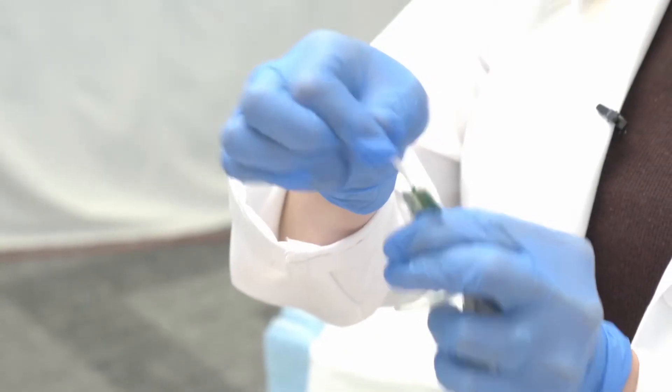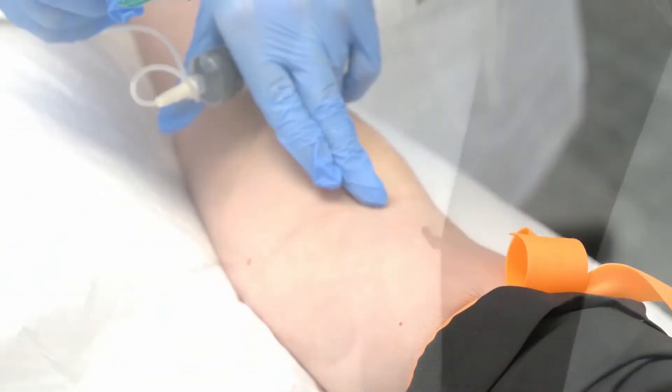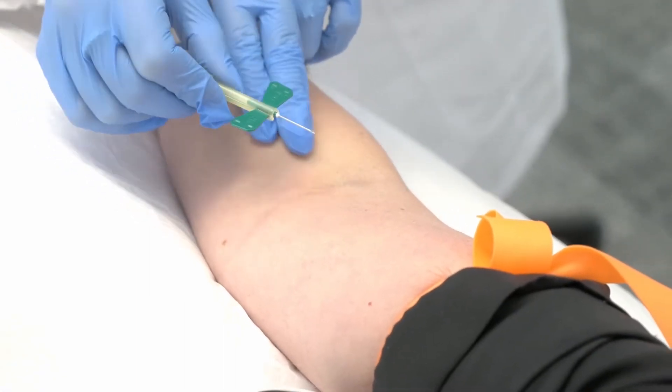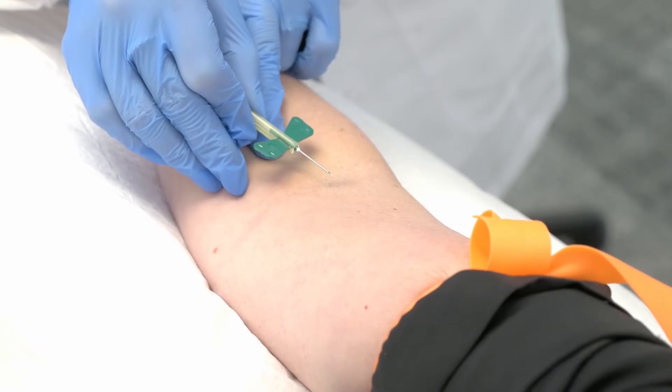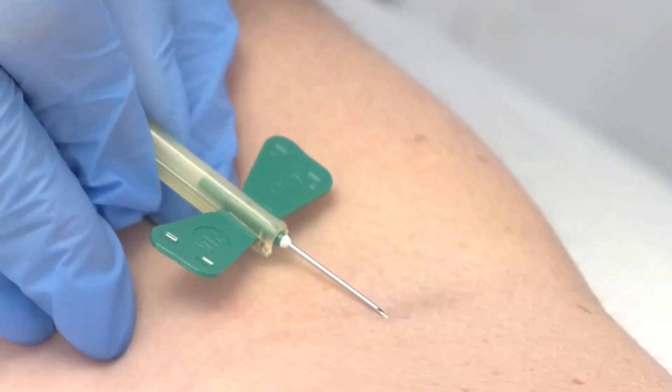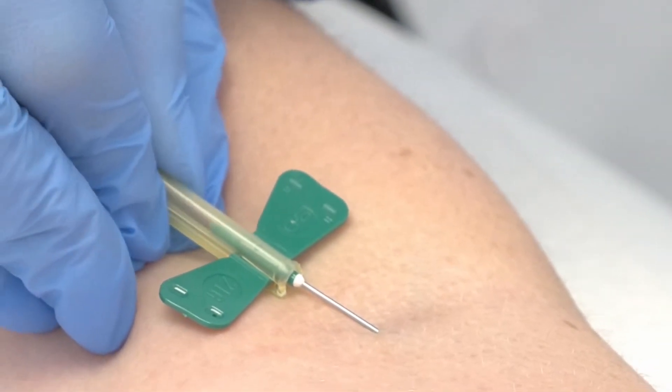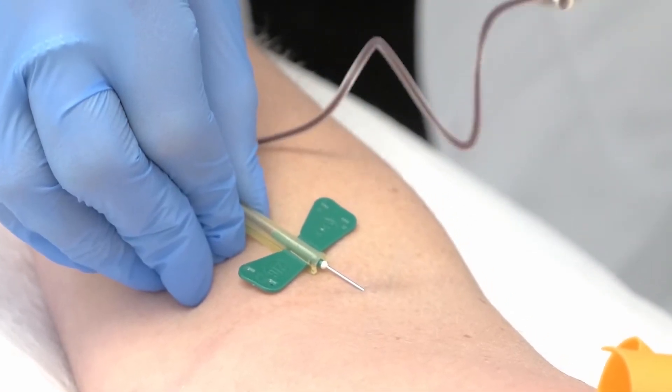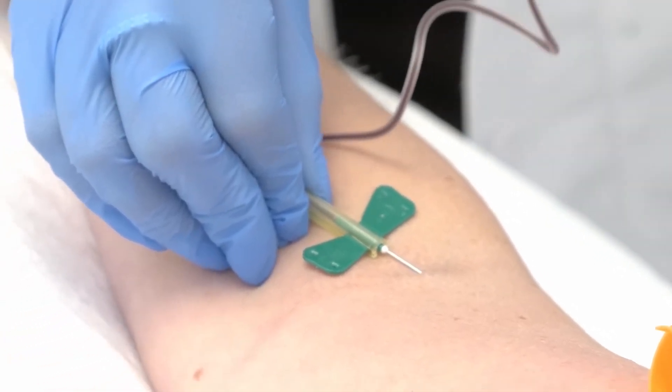Remove protective cap from needle. Pull the skin tight using your non-dominant hand. Insert the butterfly venipuncture, bevel up. You will see a flash of blood in the tubing once you have punctured the vein. An optional step here is to use the micropore tape to tape the butterfly to the patient's arm.